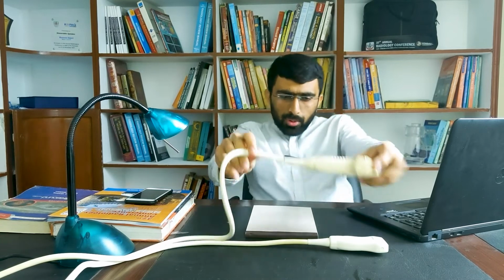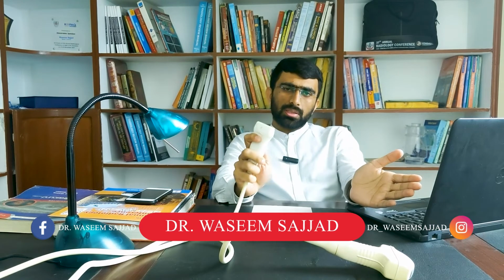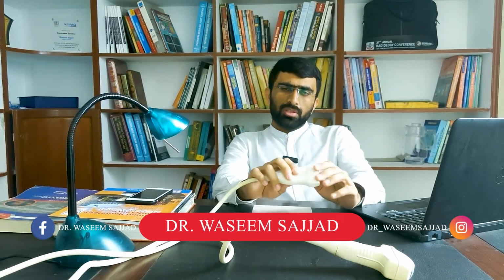The other probe is the linear probe. If we need to see the superficial structures with higher resolution, like subcutaneous planes, subcutaneous vessels or superficial veins, then we use this probe. This probe has a high frequency, but the depth of the ultrasound waves decreases in this type of probe. So you can't see the deeper structures, but you can see the superficial structures with higher resolution.